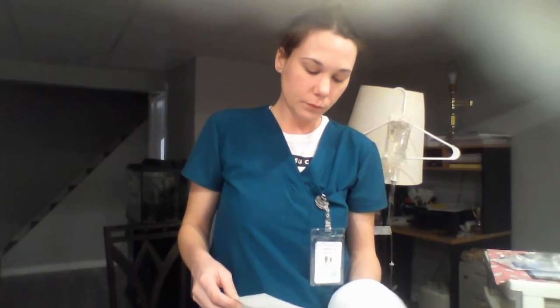So I also want to refer to my monograph about Y-site med-to-med compatibility. He's currently not on any med for his IV, so that's compatible. The solution in the mini bag is normal saline, and ceftriaxone is compatible with that. And also what's running in the main bag is normal saline, so again, that is compatible. Okay.